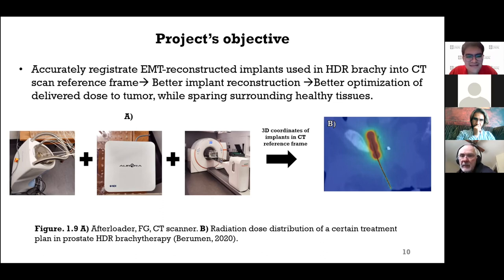For this master, I don't think so. I talked to Luke, and he told me that in order to be a clinical study, the afterloader, which is this device, has to be approved by Health Canada, because this is a prototype. Not all afterloaders have the sensor included in the check cable, and this has to be approved by Health Canada.